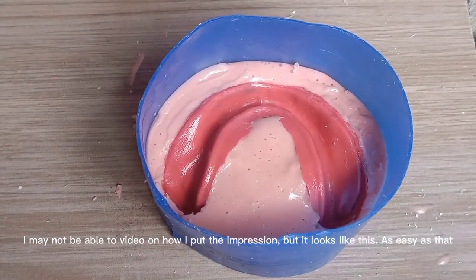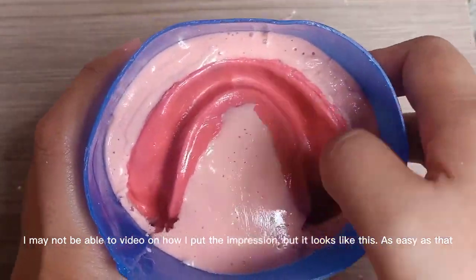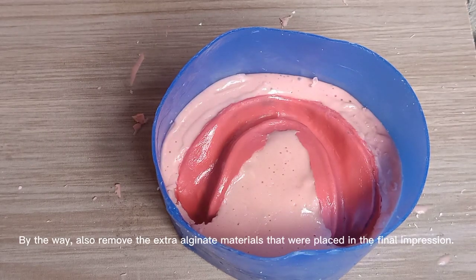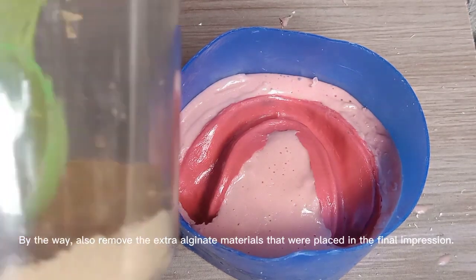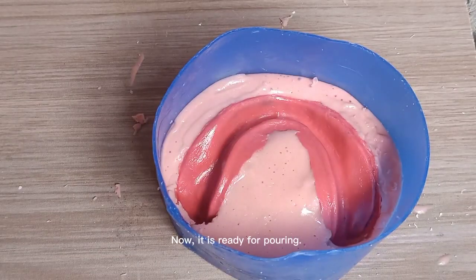I may not be able to video how I put the impression, but it looks like this. As easy as that. By the way, also remove the extra alginate material that was placed in the final impression. Now, it is ready for pouring.